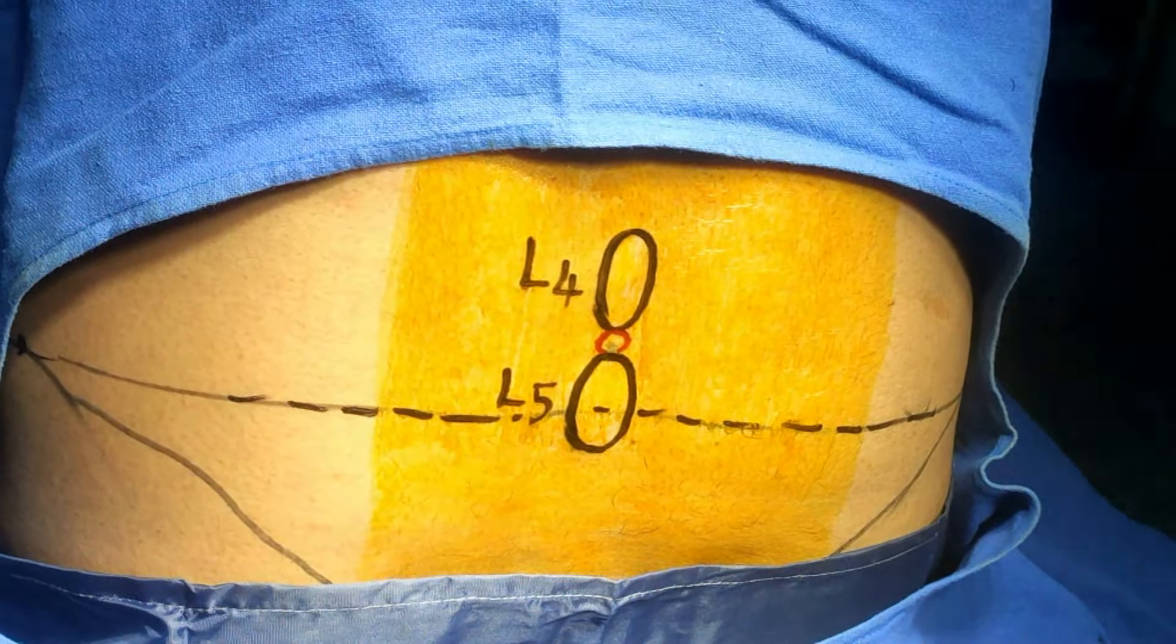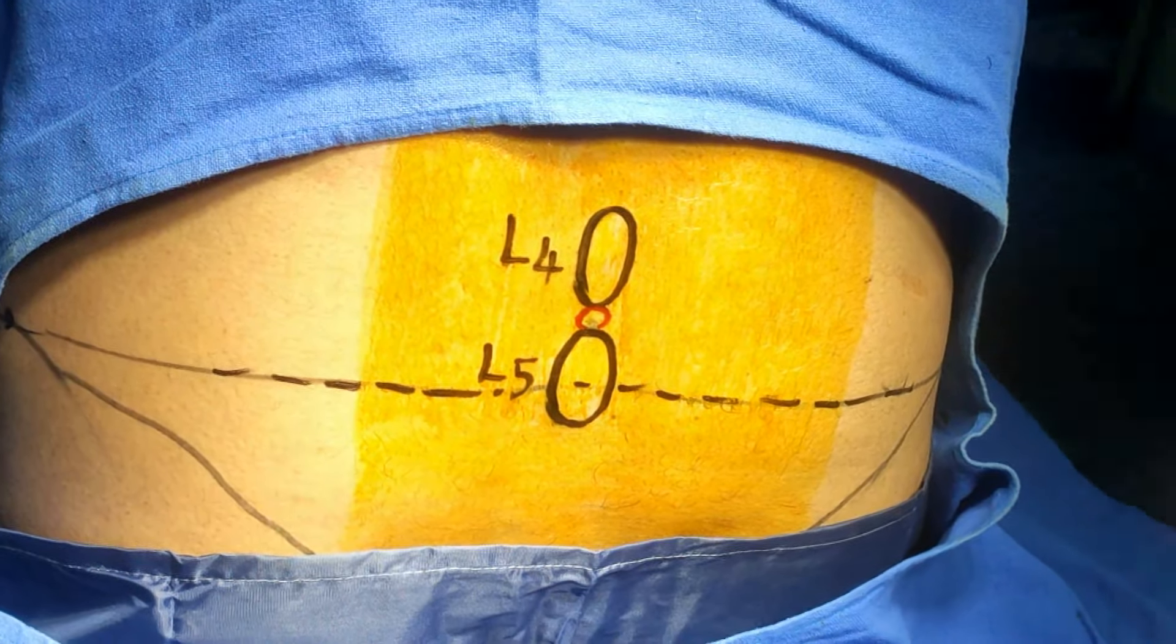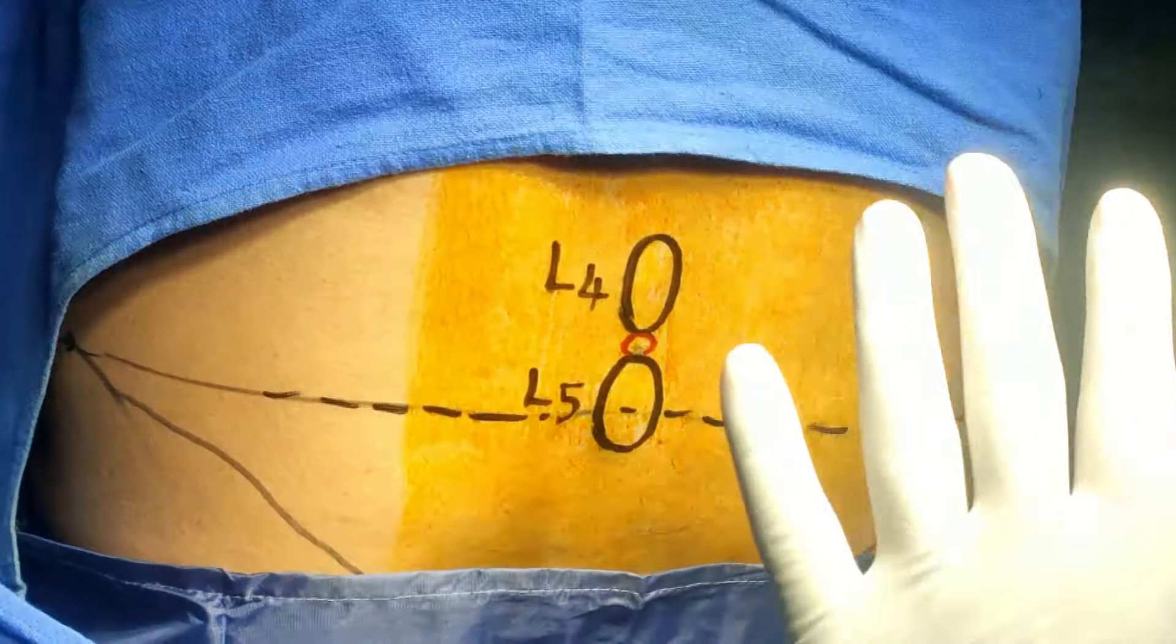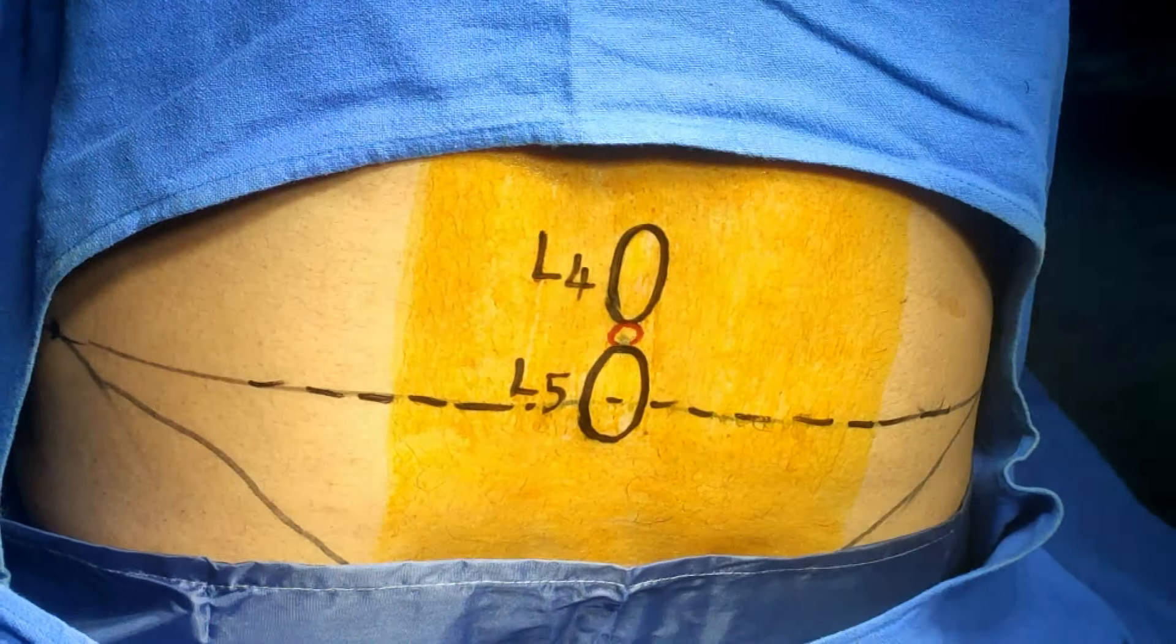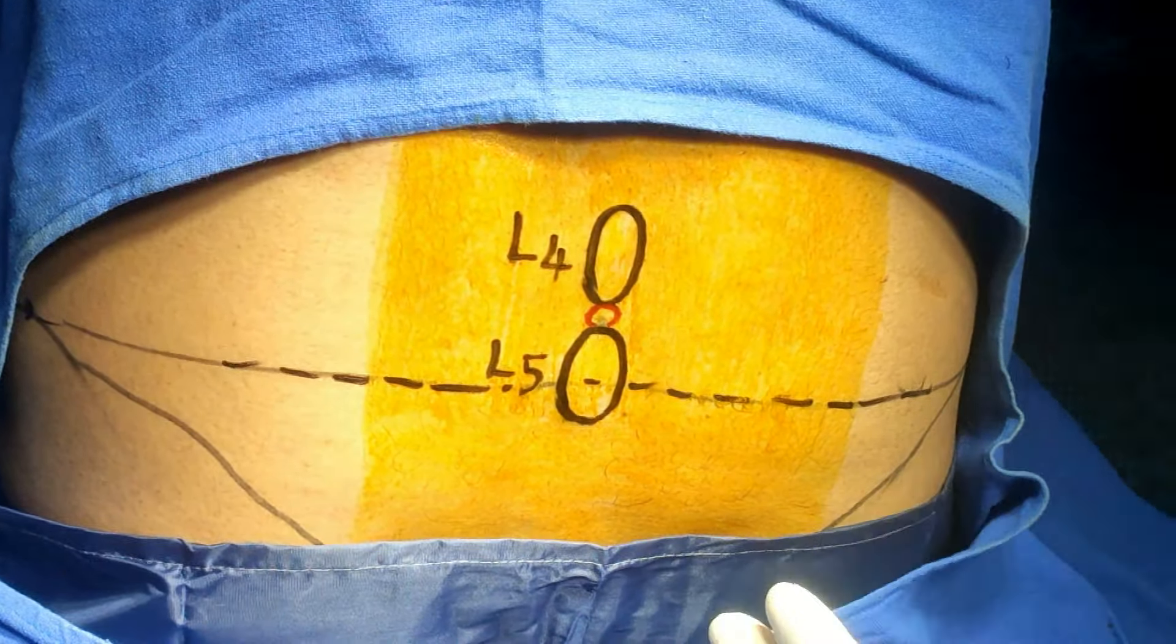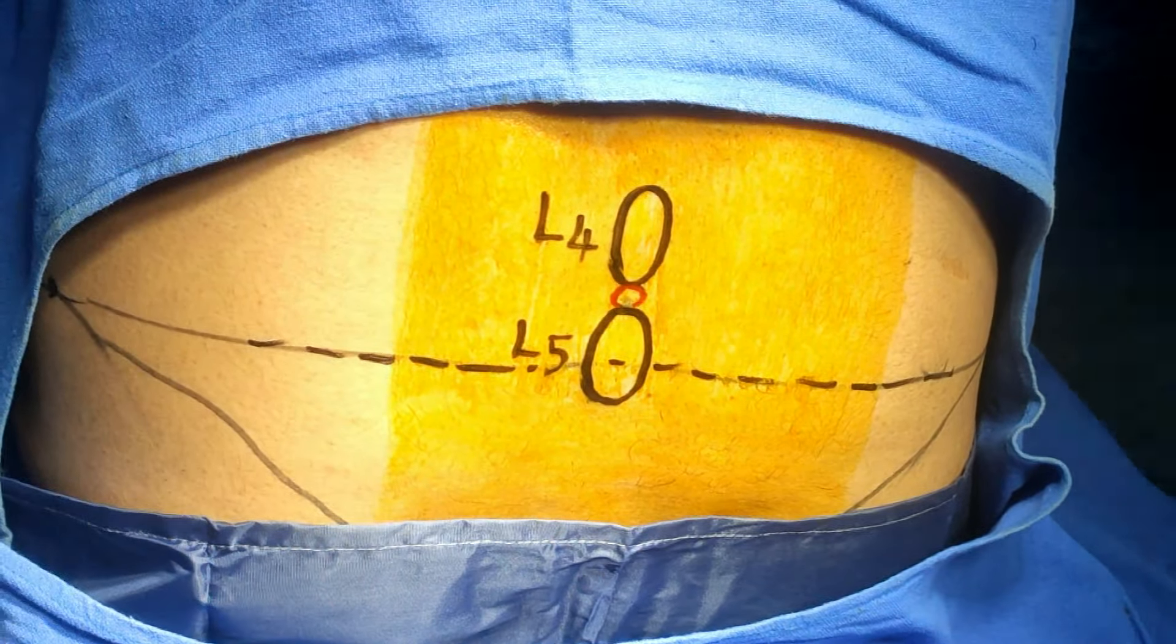This is a 65 plus year old patient with bilateral peripheral vascular disease who was a chronic smoker. I am planning to place an epidural catheter for pain management and continuous sympathetic block. Now I am demonstrating the basic anatomical landmarks.